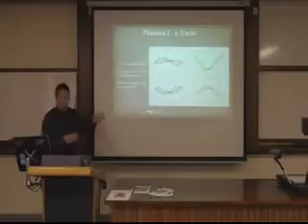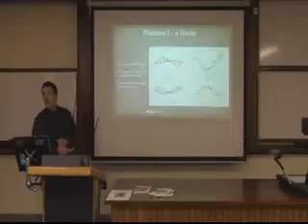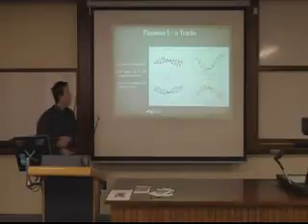But for a moving phantom, so this phantom is just phantom 1 placed on another moving phantom that gives it a sinusoidal pattern, I performed 2D tracking just for proof of concept. So if I could track in 2 dimensions, I've showed that with stereoscopic reconstruction I can accurately depict the location in 3 dimensions. So if I can track in 2 dimensions, it adds a proof of concept. So that's what this is.